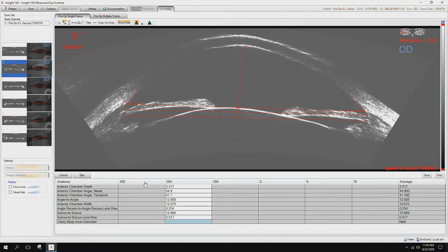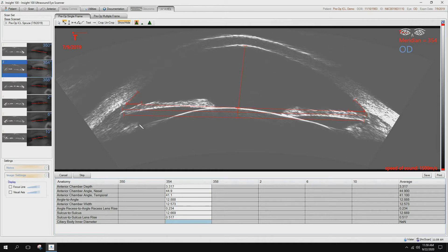Ciliary body inner diameter. These are the ciliary processes here. They're like little fingers, so you want to take the innermost region of that image. We have all of those.